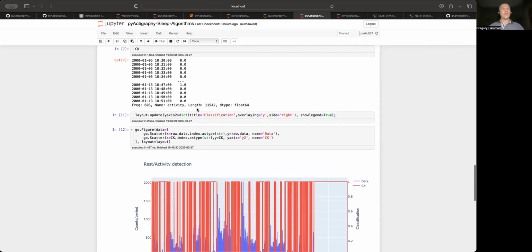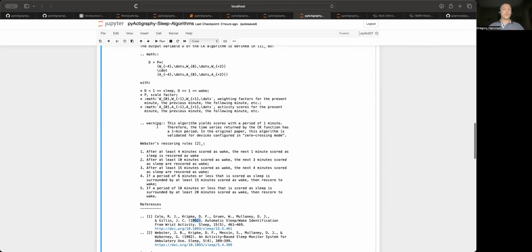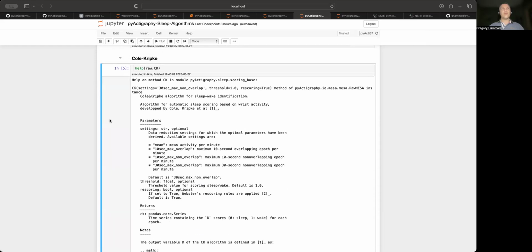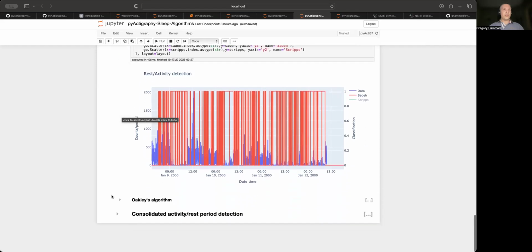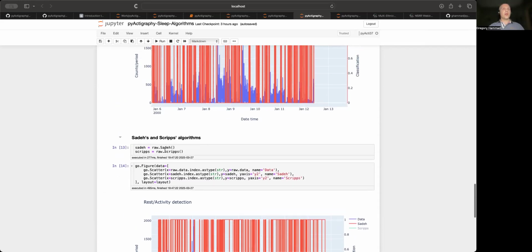So you would actually be better off by maybe tuning. So it goes back to the discussion that we had on the best algorithms for infants, for instance. So that's really a tricky business. But at least if you want to tune, if you want to modify some input parameters, you always have these input parameters.